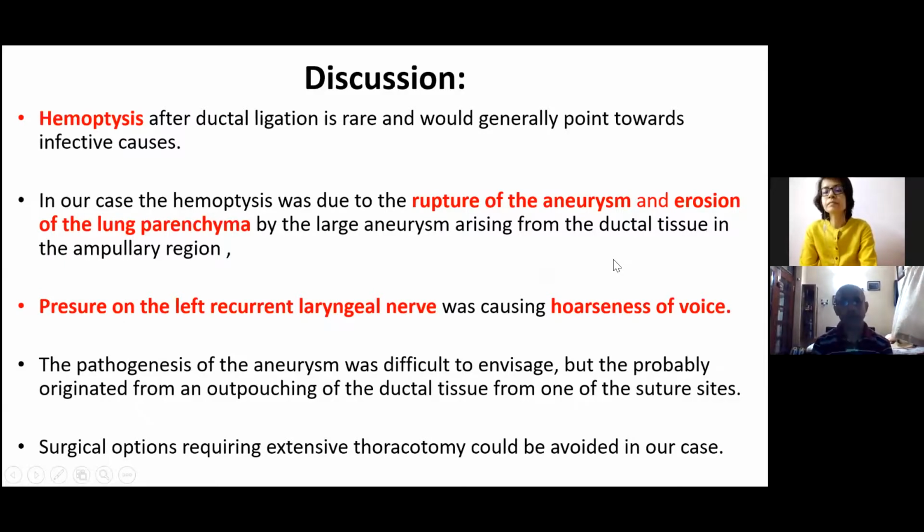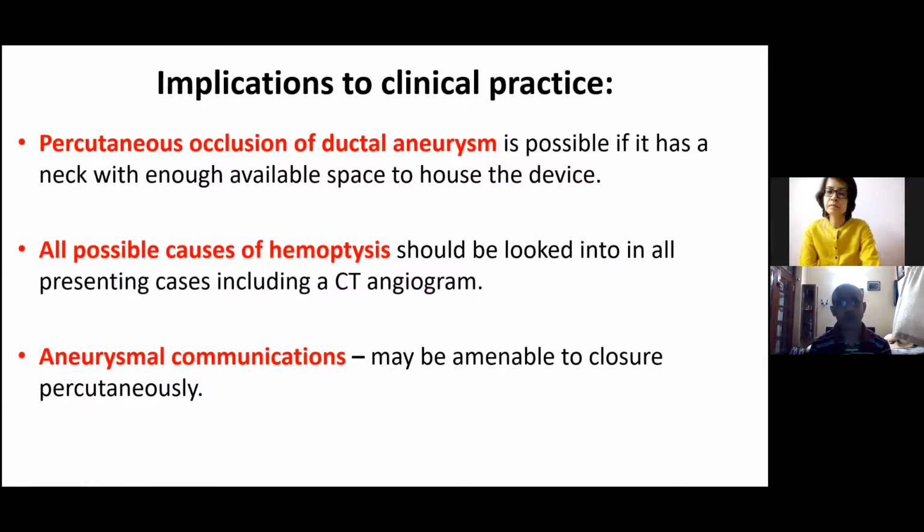And implications to clinical practice: percutaneous occlusion of ductal aneurysm is possible if it has a neck with enough available space to house the device. All possible causes of hemoptysis should be looked into in all presenting cases, including a CT angiogram, and aneurysmal communications may be amenable to closure percutaneously.